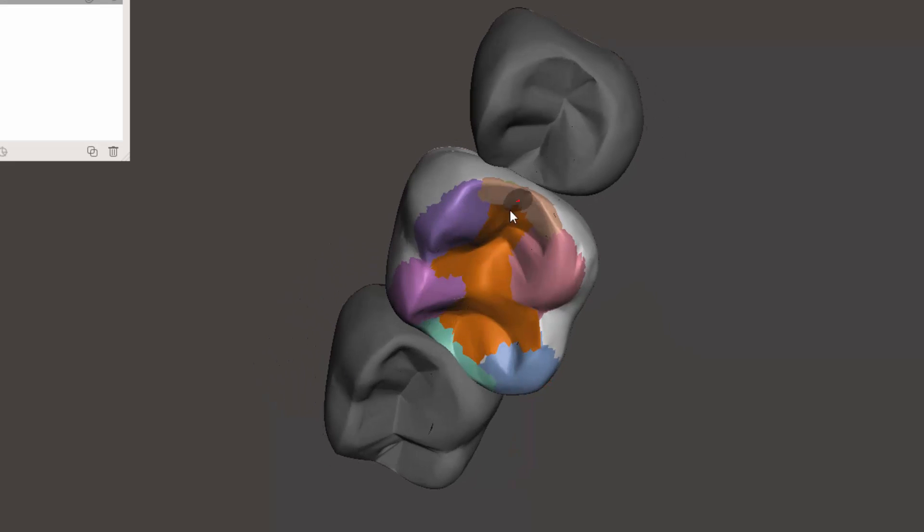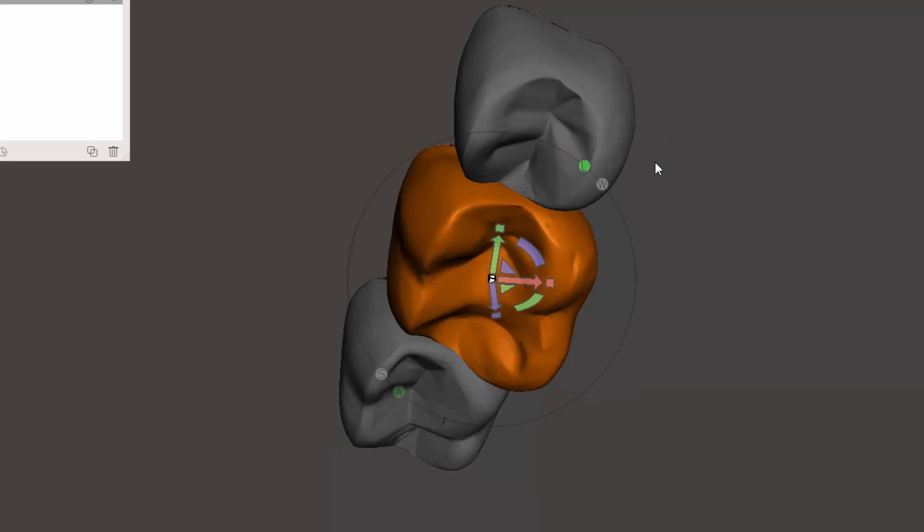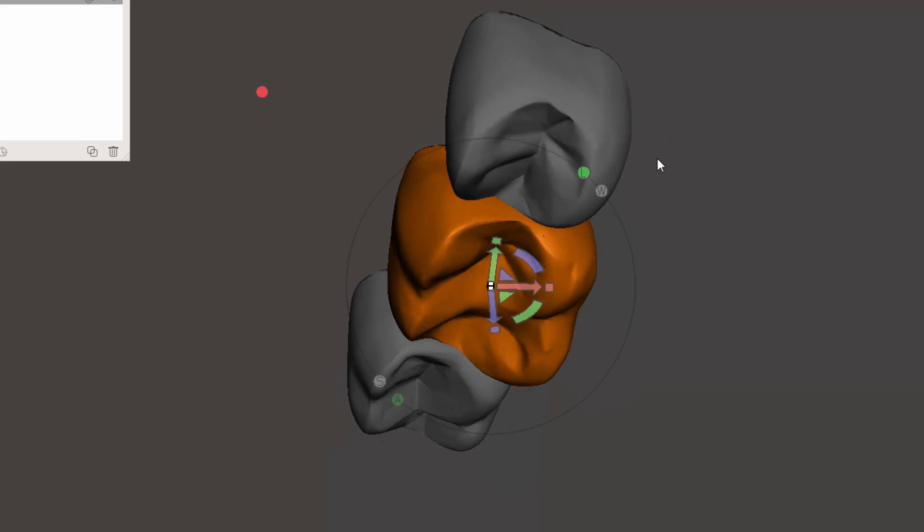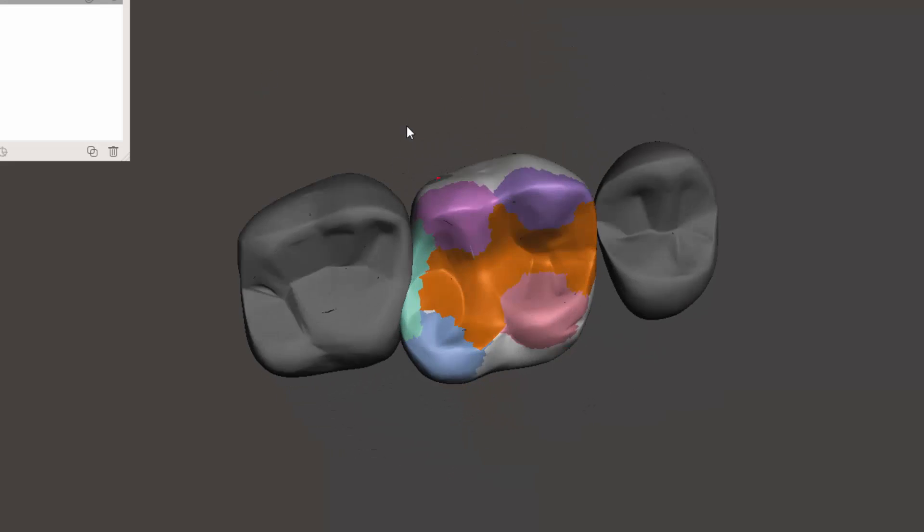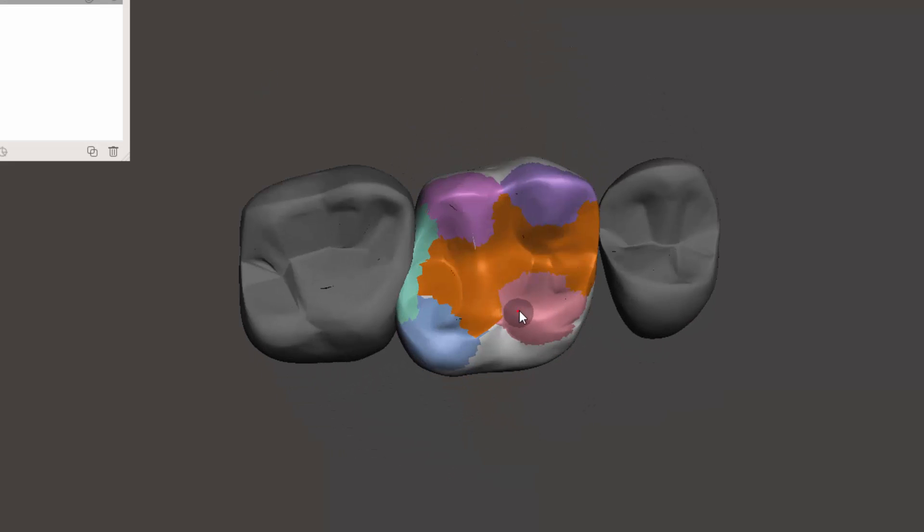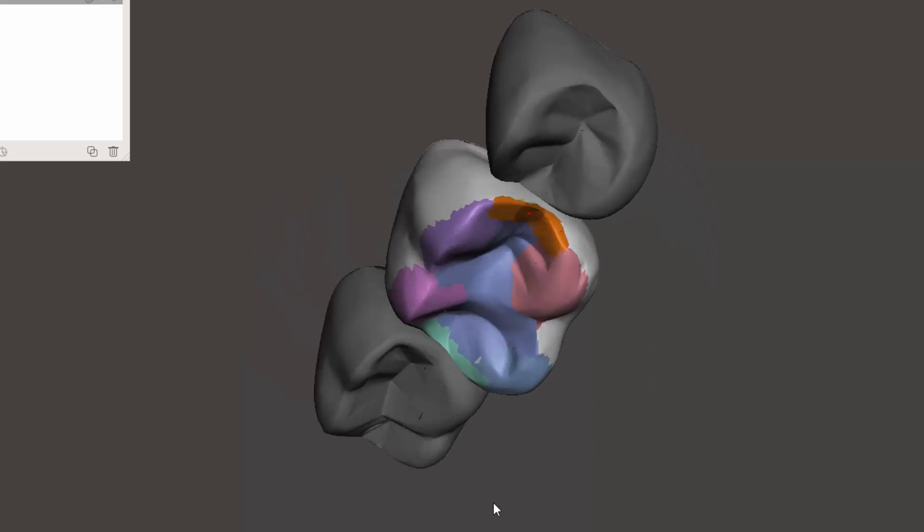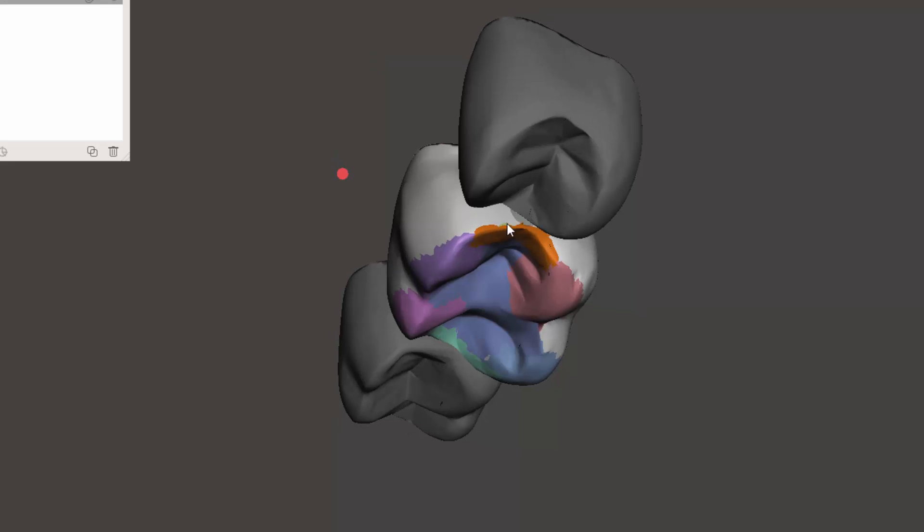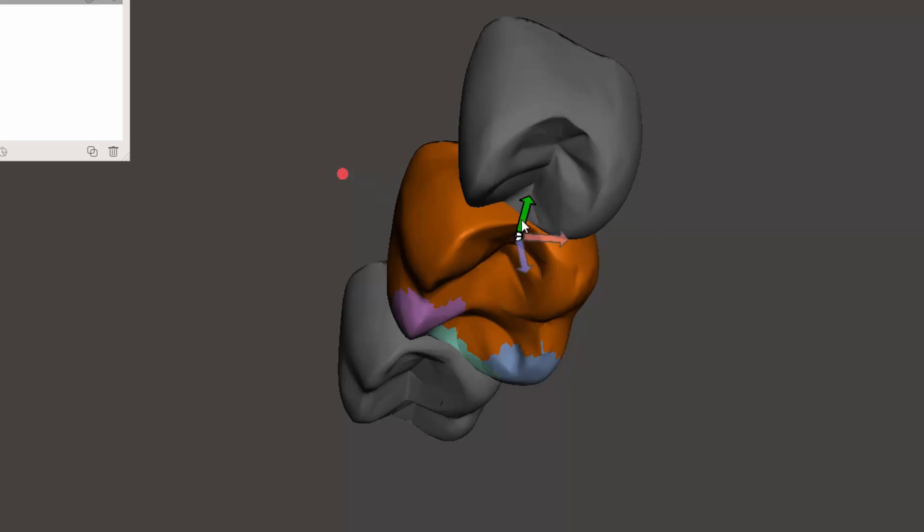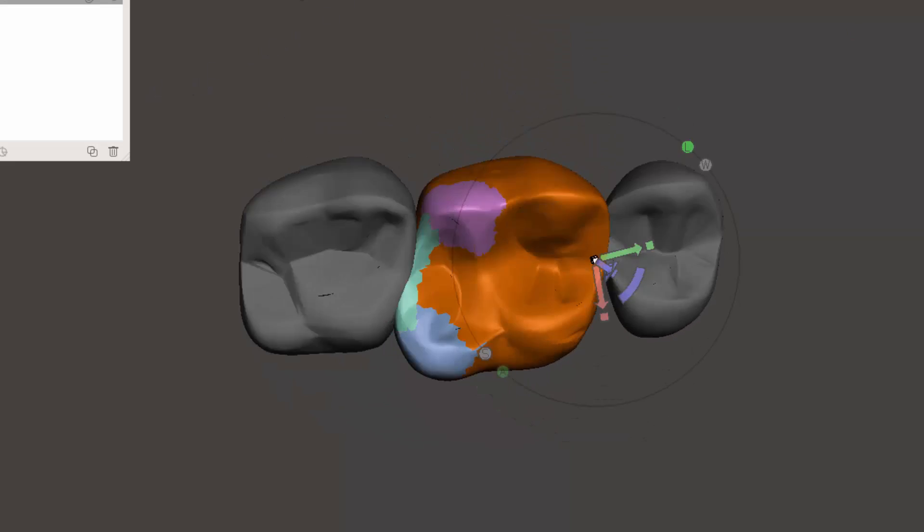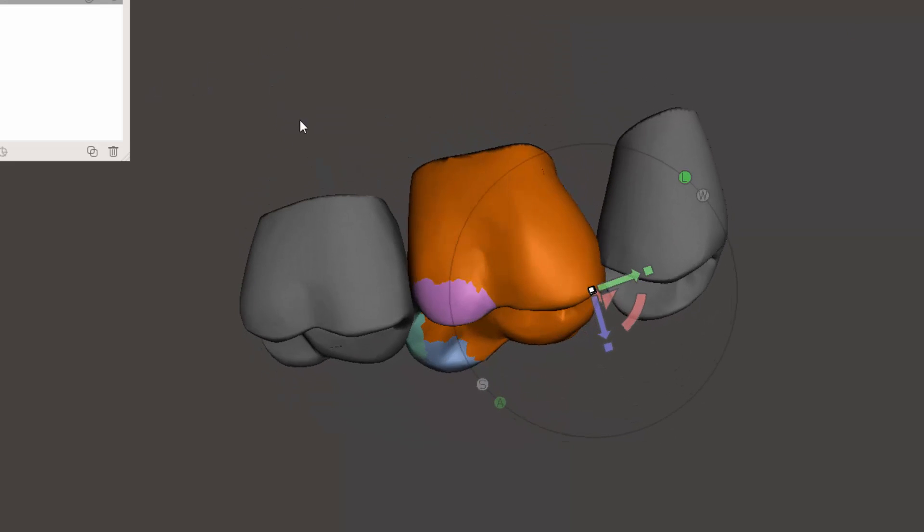But anyway, I think it's definitely something that we could work toward as far as trying to get it to allow us to refine the anatomy of our teeth specific for a true wax up.